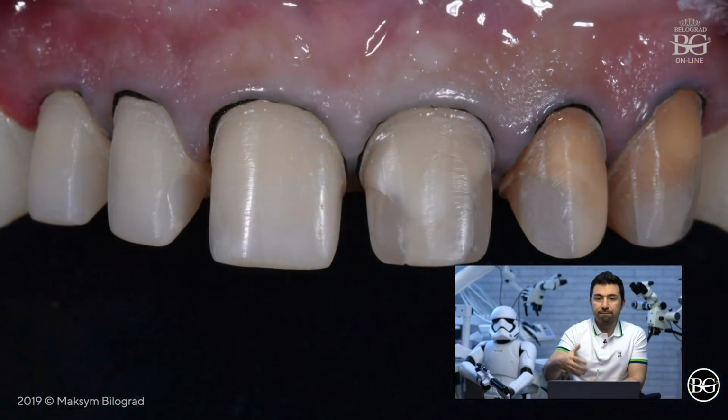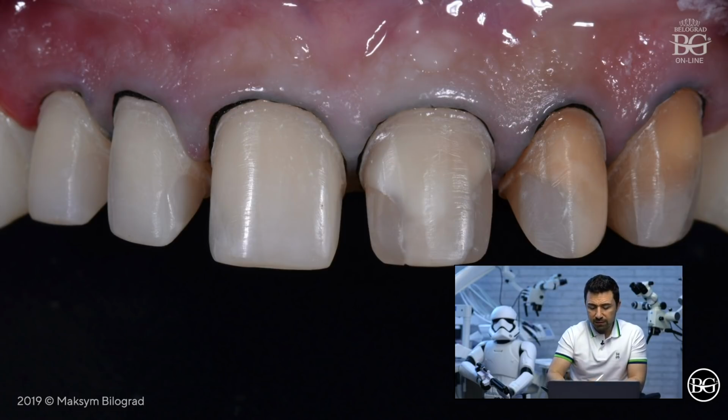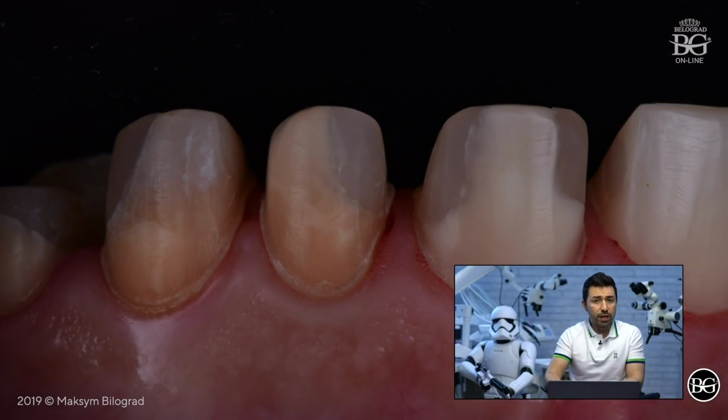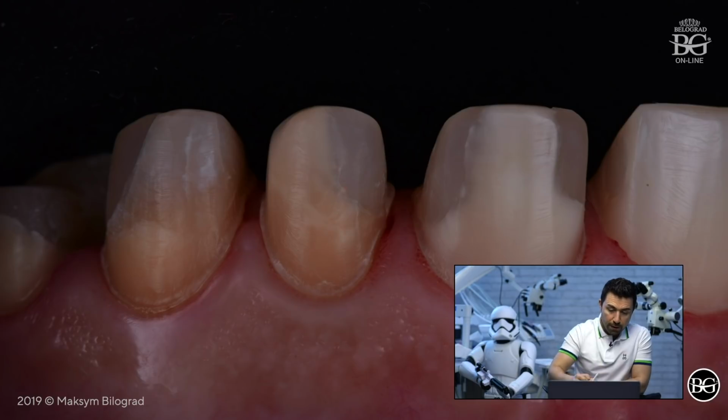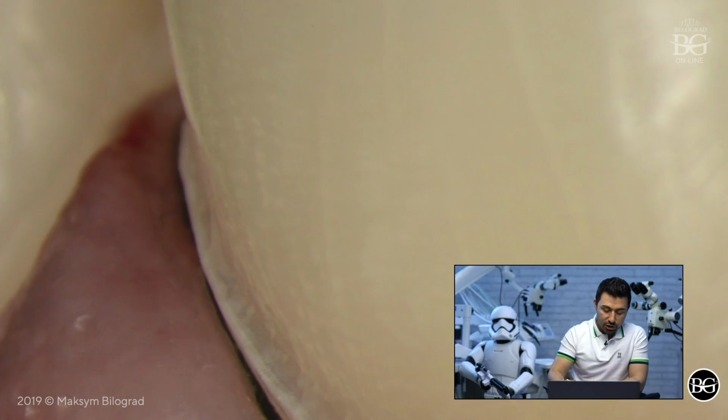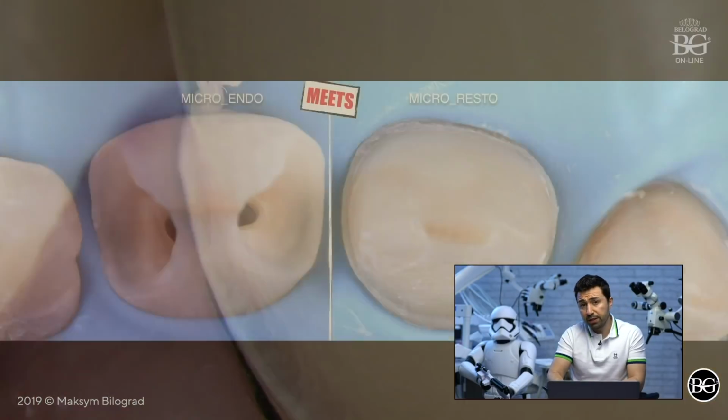Okay, so this is the final view of the prepped teeth. Then we took an impression, and after a few weeks we are about to bond our ceramic restorations, and these are the teeth after we removed the provisional restorations. You can see the condition of the soft tissues. The dental hygiene was pretty okay, so you cannot see any big inflammation, which is really good. You can see also the macro picture with enamel preserved. In this case, I made a finish line of about 0.2, 0.3 millimeters.